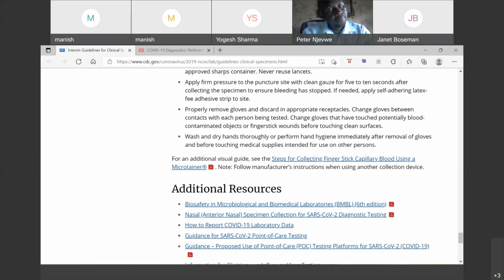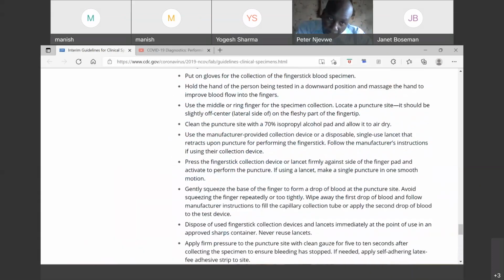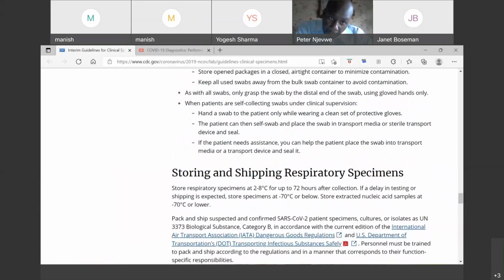So these are the general guidance, in which they have majorly given instruction for the collection of swabs and alternatives, such as the nasal wash with saline, which they have mentioned. So these are the different types of techniques. Then they have given guidance for the collection of blood in the capillary also, which we explained. Now I am taking you to the video. You will have to watch this video carefully.